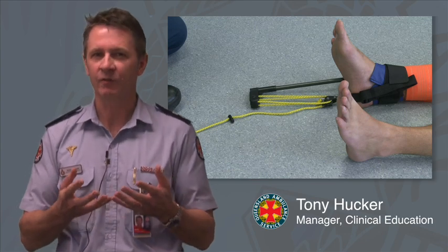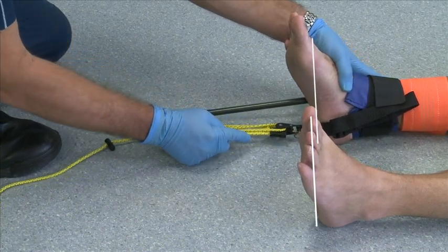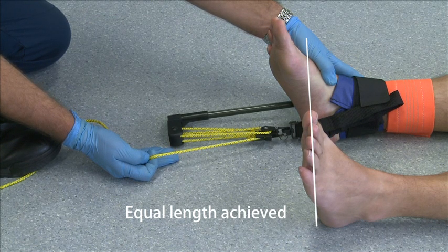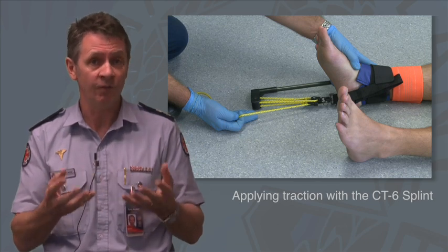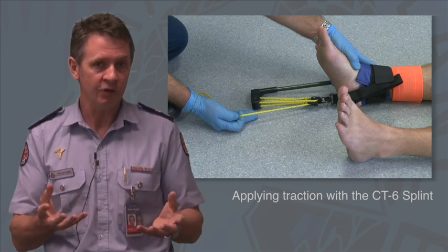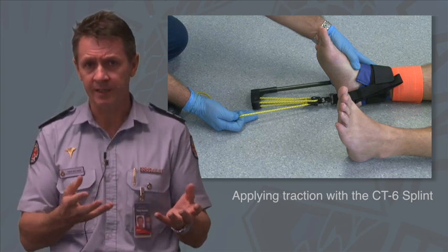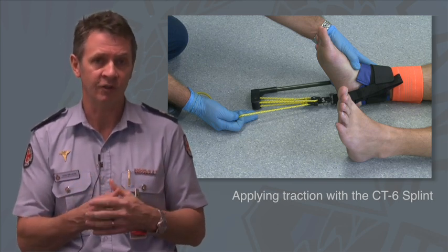With the CT6 you rely on clinical information when applying traction. When applying traction with the pulley system you should see the leg lengthen, aiming to match the length of the injured leg to the uninjured leg. In the unlikely event of a bilateral femoral shaft fracture, watch the legs and observe the effect of traction on the thigh area for feedback. Remember: traction is very important. If there is a compound or open fracture, liberally wash the wound with at least a litre of normal saline — you don't want bone retracting into the thigh cavity covered in dirt — so wash thoroughly before traction is applied.